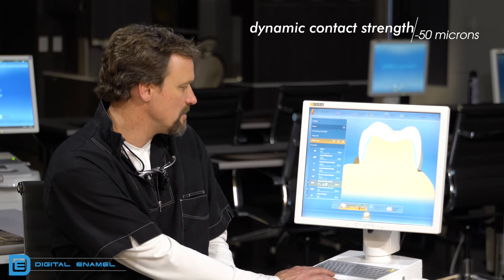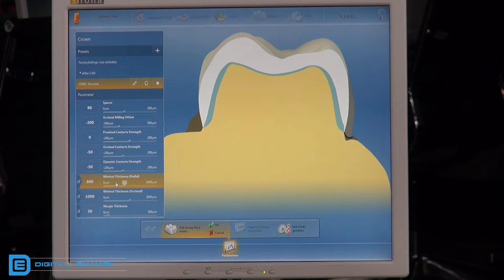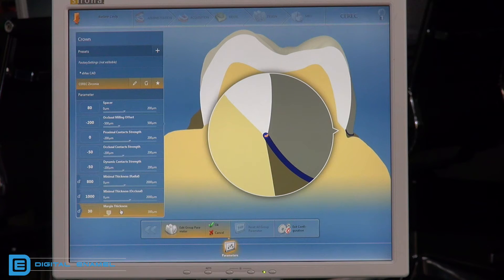The minimal thickness radial — that's 800 microns — not at the margin but along the axial wall all the way around. The minimal thickness for the occlusion should be set at 1000 microns, or one millimeter. Margin thickness depends on how fast you're milling: in the fine setting it should be 30 microns; in fast mode it must be at least 100 microns. It won't allow you to mill in fast mode unless your margins are set at 100 microns.